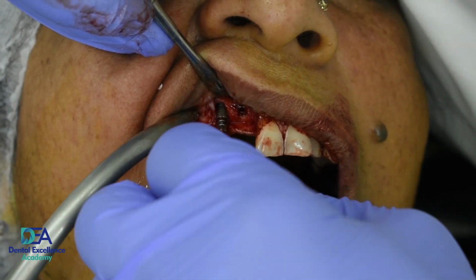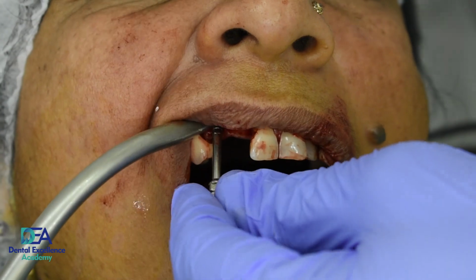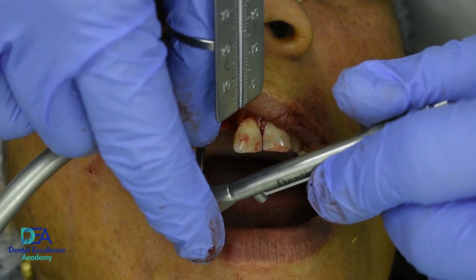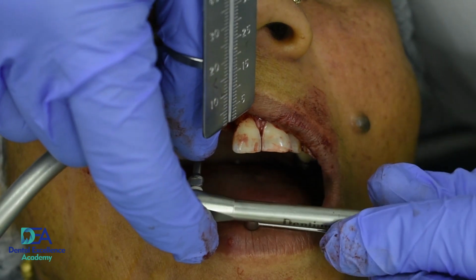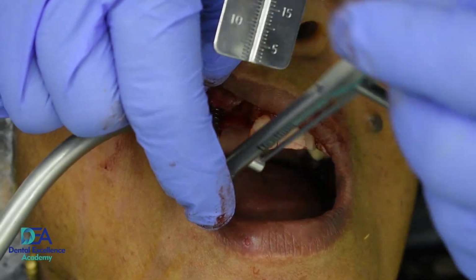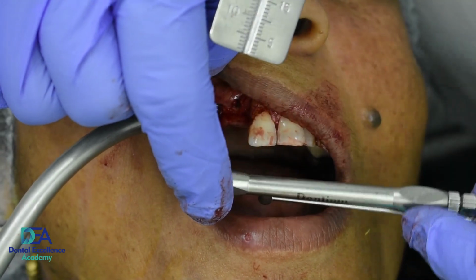First the implant slipped distally, but again I corrected the direction so that I can be parallel to the adjacent implant. Sometimes radiographically we cannot judge whether it is parallel or not, but clinically we can see it is almost parallel.